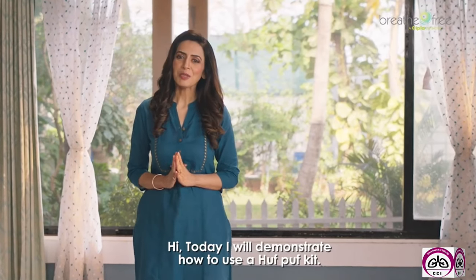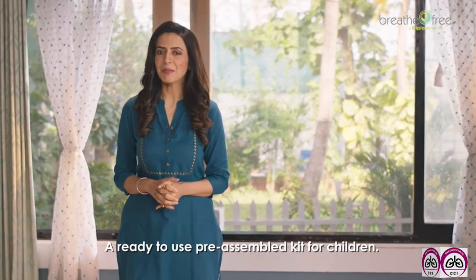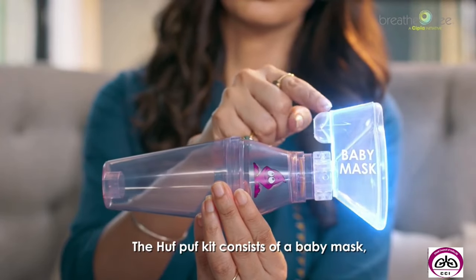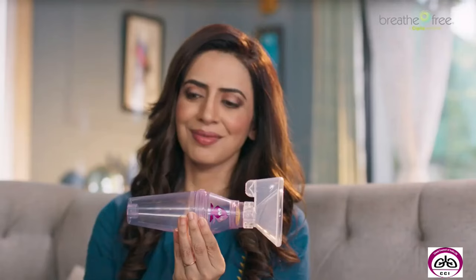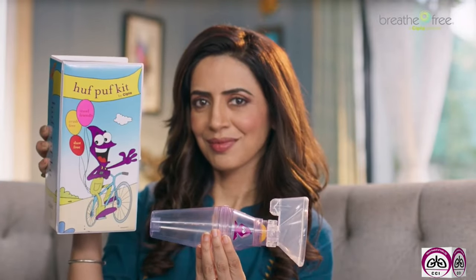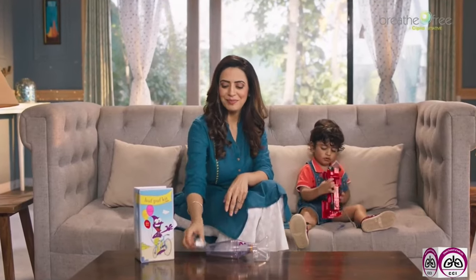Hi, today I will demonstrate how to use a Huff Puff kit, a ready-to-use pre-assembled kit for children. The Huff Puff kit consists of a baby mask, a Zerostat VT spacer, and a slot to insert a PMDI. It also comes in a robust storage case. So let's look at how to use Huff Puff kit.